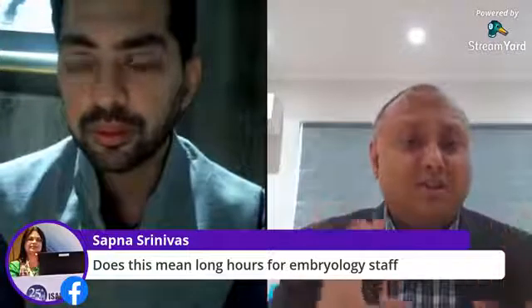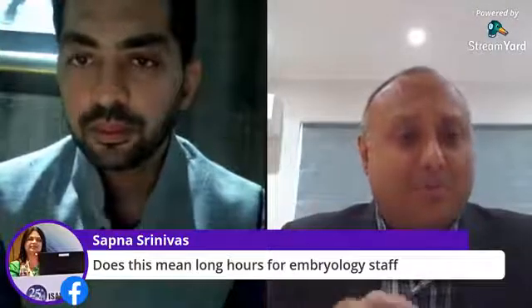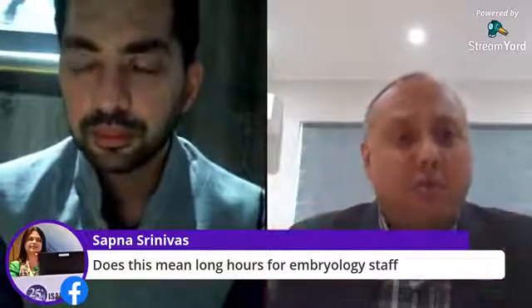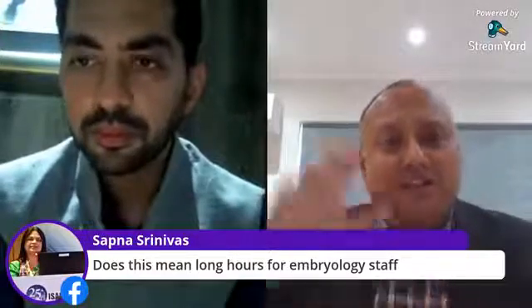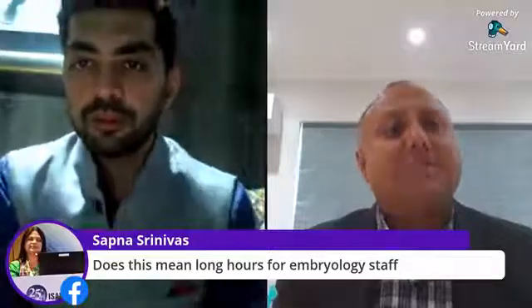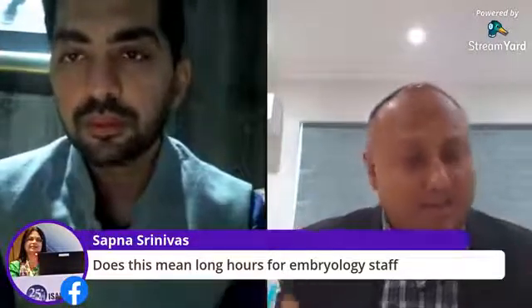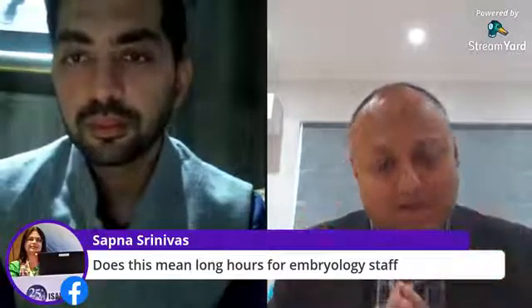Once we've finished using a semen sample from the pot, you don't just discard it straight in the bag. You add water to it, dilute it to reduce the bioburden, close the cap very tightly, and put it in a clinical waste bag. The second thing is about waste disposal. All the bags are supposed to be double bagged. In a normal scenario, we would just have one bag, but in this scenario, we're double bagging all the waste that is coming out.